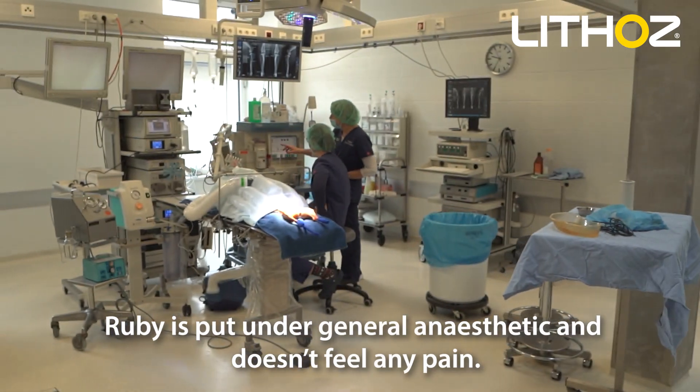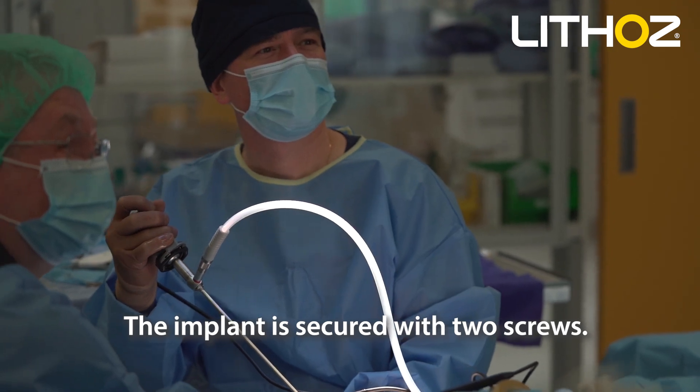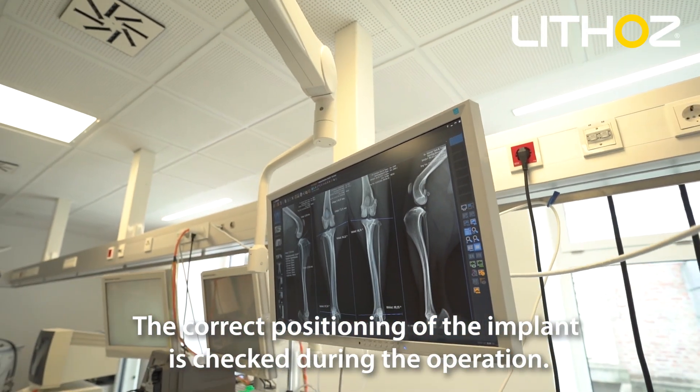Ruby is put under general anaesthetic and doesn't feel any pain. The implant is secured with two screws. The correct positioning of the implant is checked during the operation.